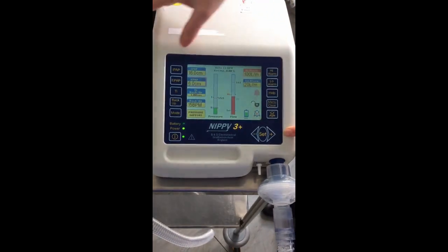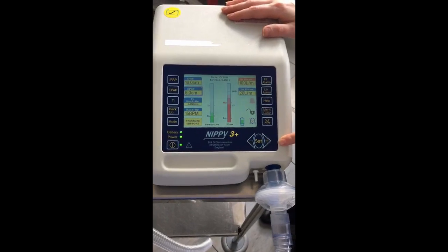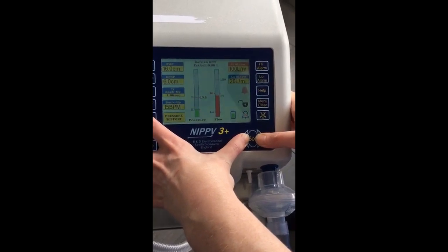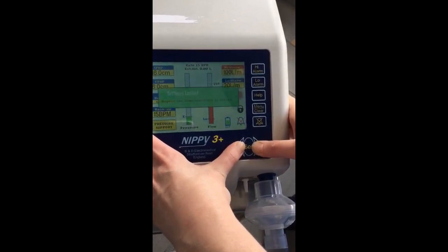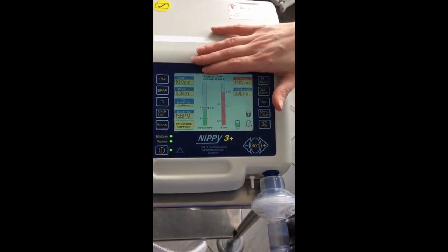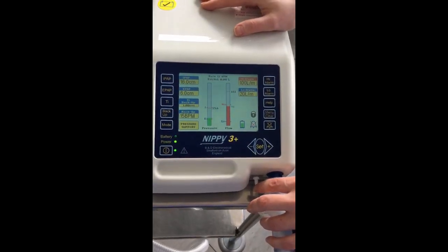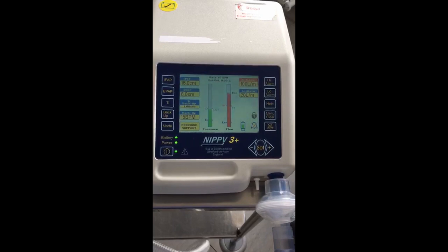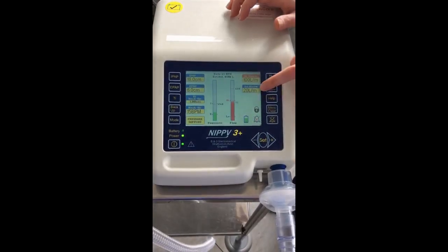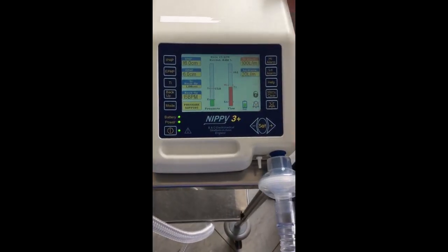Now we have IPAP set at 16, EPAP at 6, and the machine is on pressure support. Before we leave, we lock the machine by pressing plus and minus together. This is the safe setup of a BiPAP machine. In terms of alarms: a high flow alarm indicates a leak; a low flow alarm indicates a blockage such as kinking in the tubing; and there is also a battery alarm. The machine is currently alarming due to a high flow alarm because of a leak and because it is not plugged in.